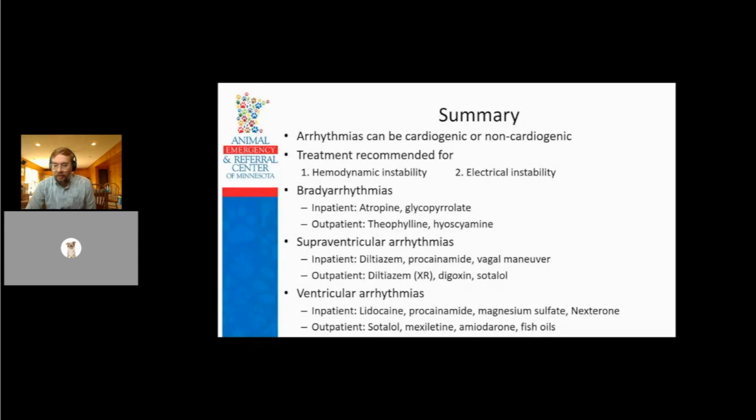Is a respiratory sinus arrhythmia in a cat, especially a relaxed, friendly cat, or a cat on gabapentin, even considered normal, or is it something that always warrants workup? Good question. I think of the attitude of the cat: is it relaxed, calm, sleeping, purring? Is it on gabapentin? Gabapentin in cats I find frequently does cause lower heart rates. Usually they don't come in bradycardic at 60, but their heart rate may be 120 even when they're stressed in the hospital. I feel like they're usually still pretty regular. But those are things I'll be thinking about.